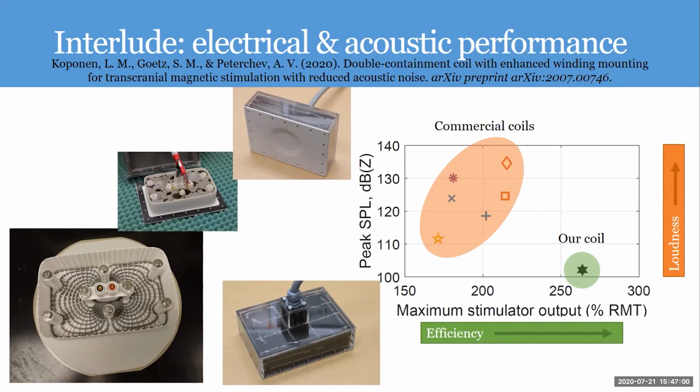Thanks for the talk, Lari. Really impressive work. So, for example, for this QTMS coil, will this see continued development, or is it kind of a proof of concept for now? So yesterday, for the first time in 4 months, I got to get back to the lab, and every part you see in this coil here is to be still replaced with improved parts.